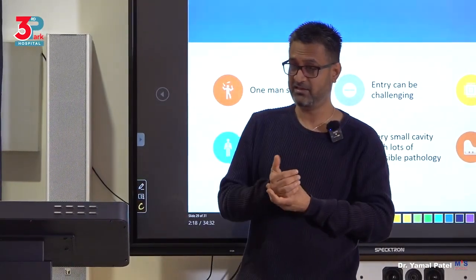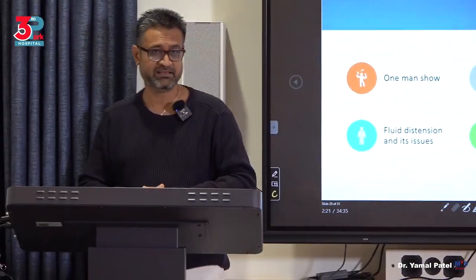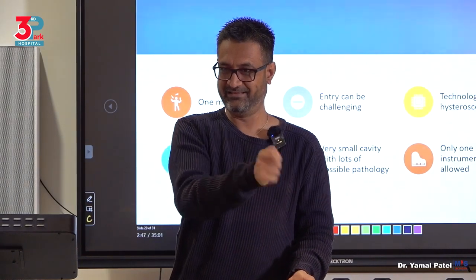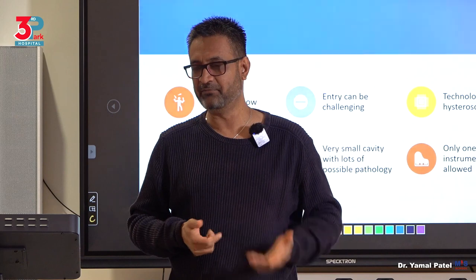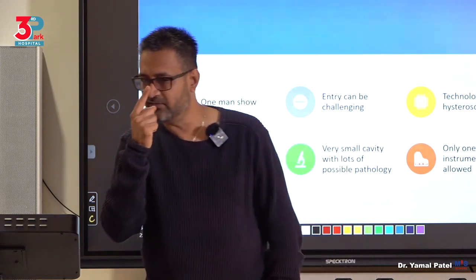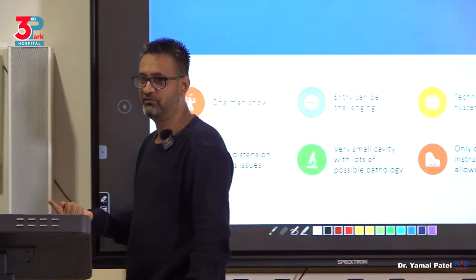If you're assisting me and you assist me with one hand, ask my team what happens. I get upset. Okay? You should be able to understand that surgery in laparoscopy is two-handed. Surgery in open surgery is two-handed. But surgery in hysteroscopy is one-handed. Yes, I'm still using two hands, but what I meant was one is my view and only one is my operating instrument. That's what I meant by one hand. I'm not saying I'm not still going to be doing this. I'm still doing it with two hands, but my operating instrument can be handled with one hand. You've understood what I'm saying?